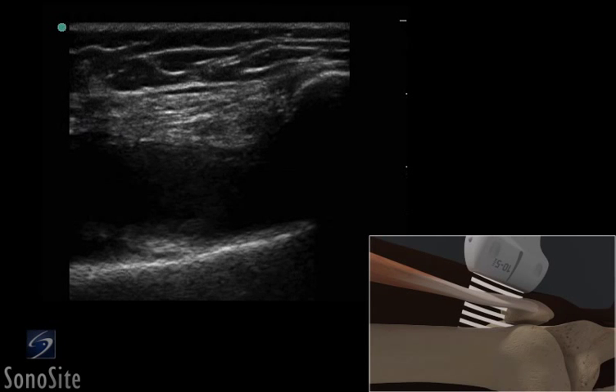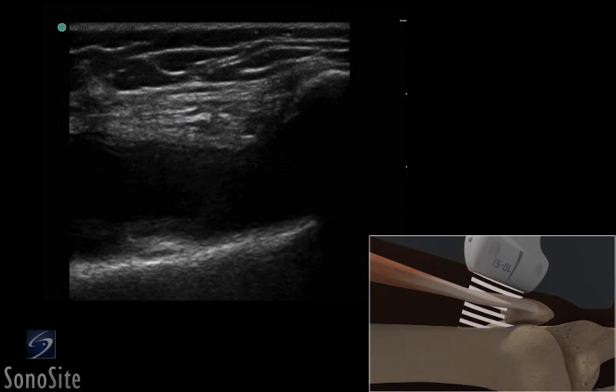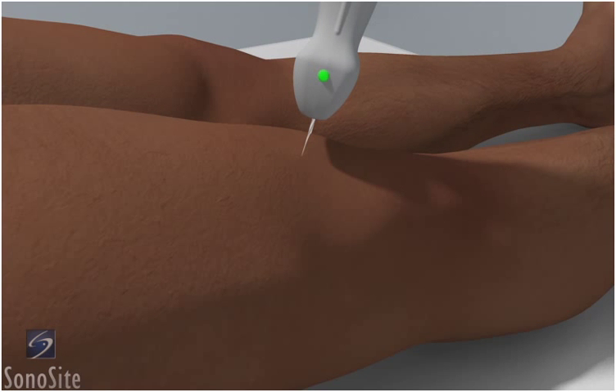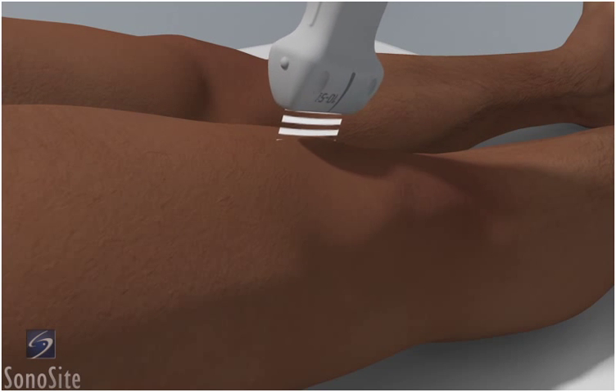A linear array transducer with a musculoskeletal exam type is used to perform an ultrasound-guided knee injection using a medial approach. The patient is in a supine position with the leg extended.